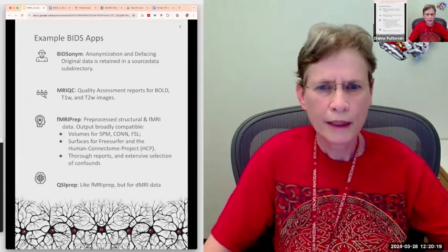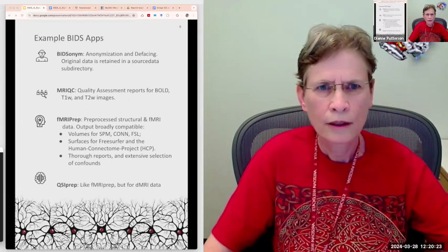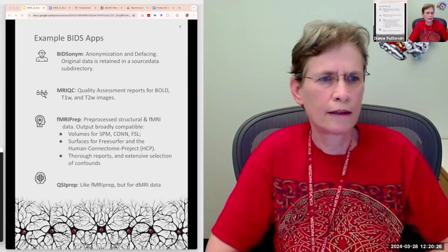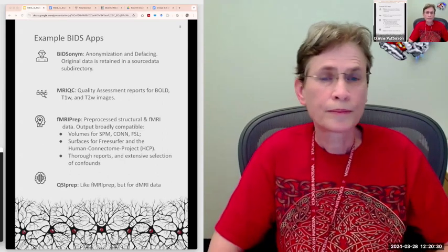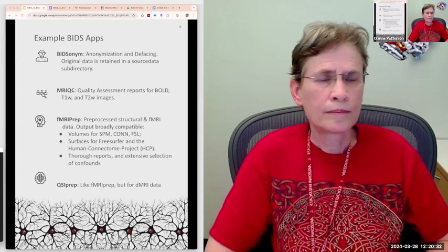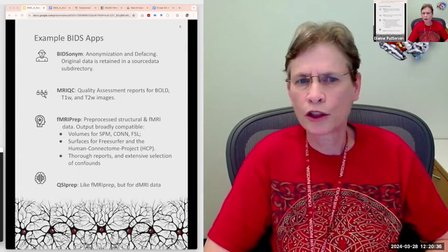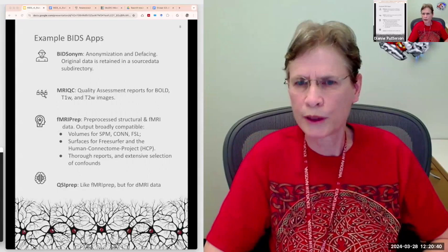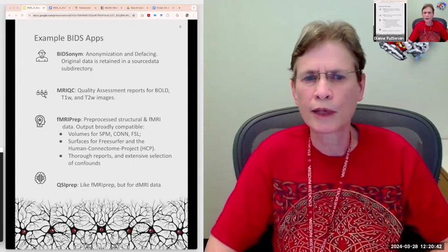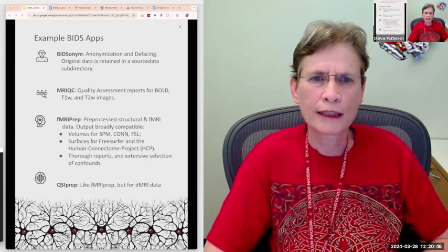Okay, so here I'm going to showcase 4 apps that I use regularly and that I use to teach. BIDSonym for defacing, MRIQC generates quality control reports, fMRIPrep does fMRI pre-processing for you, and QSIPrep does dMRI, or diffusion MRI processing for you.